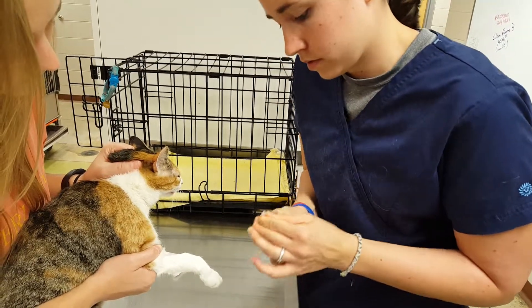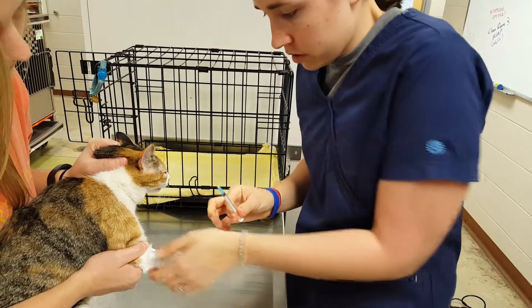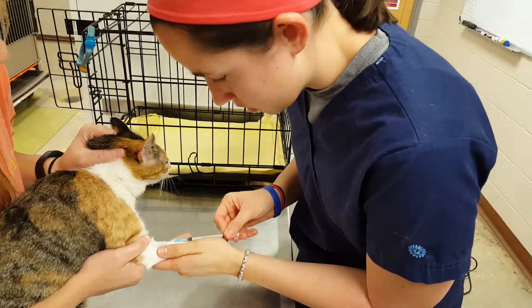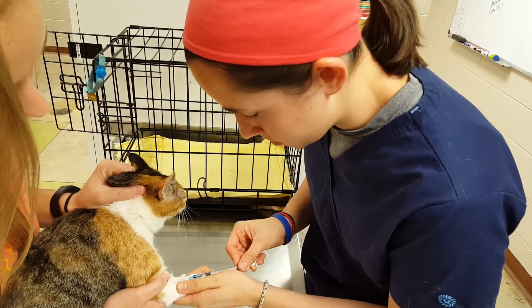I'm going to take my cap off, make sure my bevel is up, and hold the syringe between my thumb and index finger. I'm going to insert and extend the plunger with my middle finger.